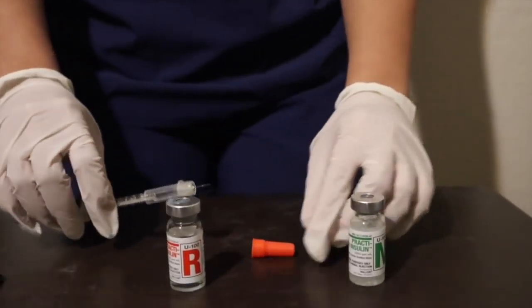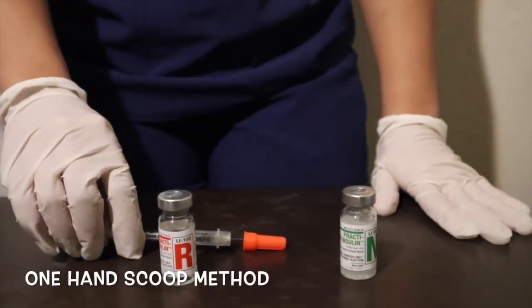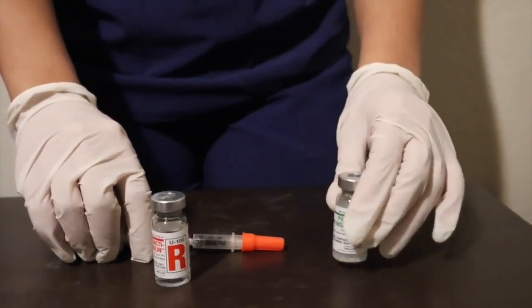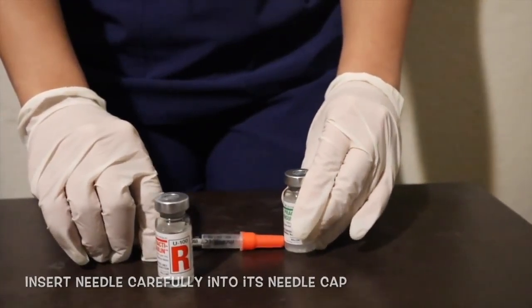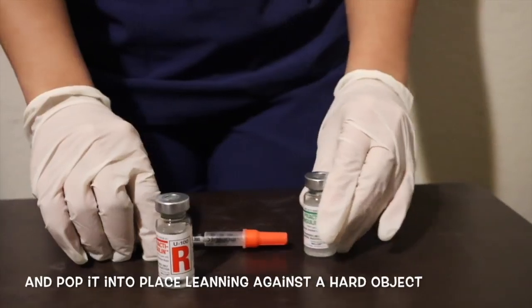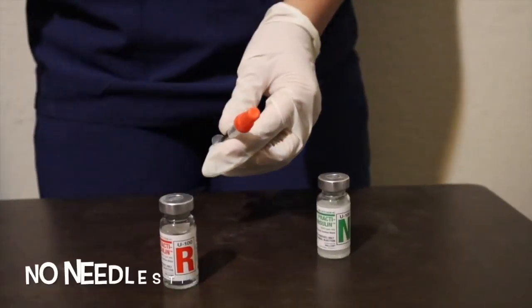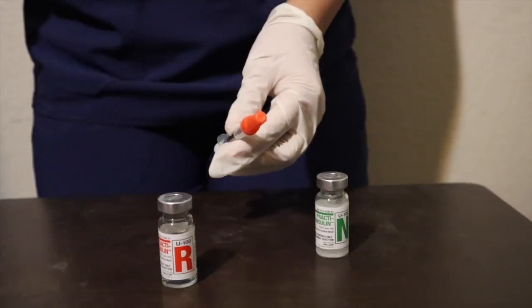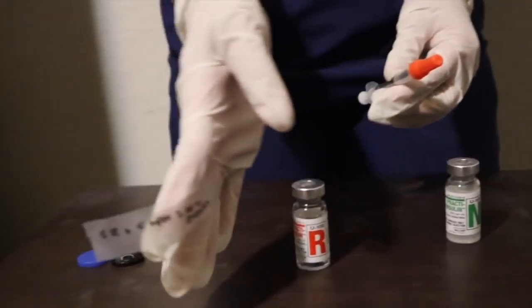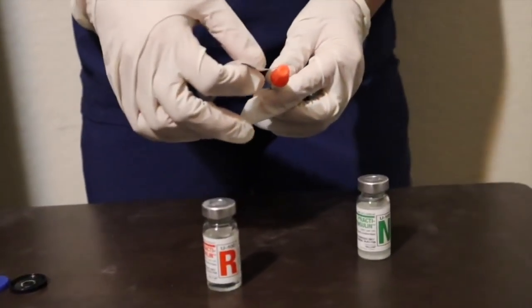I don't want to contaminate the clear insulin vial, which can affect the action of the insulin. If you are not injecting the medication into your patient right away, then I recommend the one-hand scoop method, which is using any hard object — in this case, the vial — to insert the needle carefully into its cap and pop it into place leaning against a hard object. This prevents me from poking my fingers if I were to miss. You can use the wall, a desk, a water bottle, anything that is hard. I will label the syringe with how many units I have mixed.